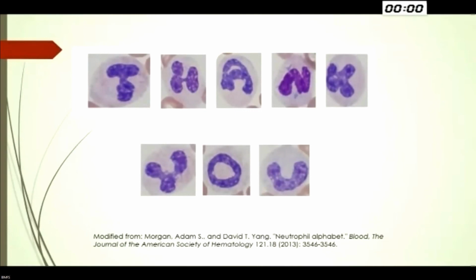So the conclusion is, just the way all that glitters is not gold, all that is dysplastic is not MDS, but in spite of all that, morphology remains the cornerstone for diagnosis of MDS, even in 2022.